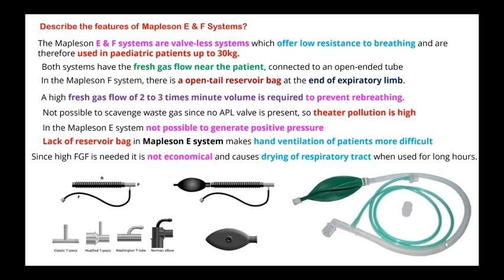This is a modern T-piece modified by Mapleson, where you have this tail with a white valve attached here. So the original description did not have this valve. But to make it convenient for us to do hand ventilation, we are using this valve, and we can adjust the opening here by threading this valve, tightening or loosening it.